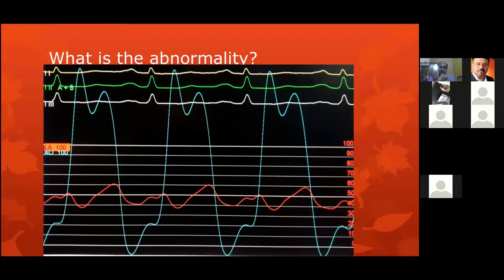The same electrical impulse that excited the ventricle now also excites the atria, so the A wave is coming together with the C. Both together, the tricuspid valve closure with the powerful atrial contraction against a closed tricuspid valve, result in an enormous shooting up of the A wave. This A wave comes in the neck as sudden flicks. I already mentioned the A wave is a brief event like a spike. Now that spike becomes a cannon because the atria is contracting against a closed tricuspid.